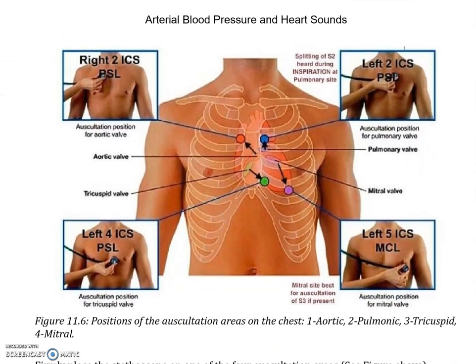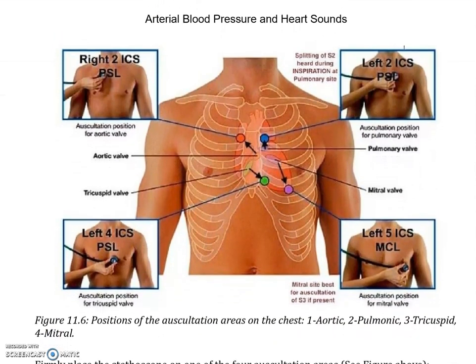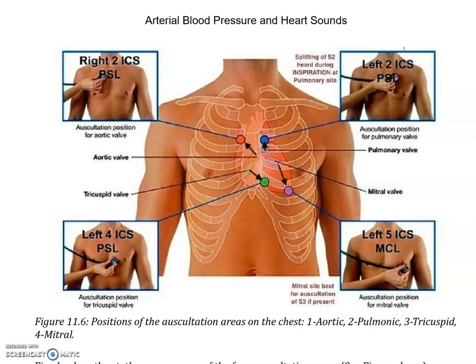But here, if you have a stethoscope somewhere available, you should listen to your heart sounds in different positions where you can hear them loudest. Of course, if you put your stethoscope directly over the valves that you want to listen to, then you hear those louder.